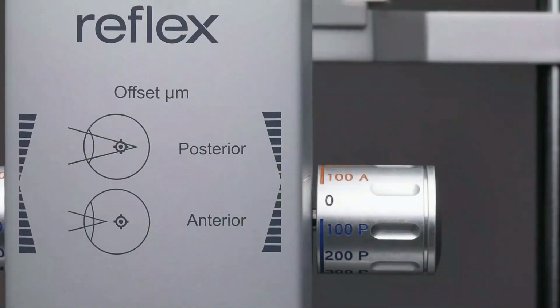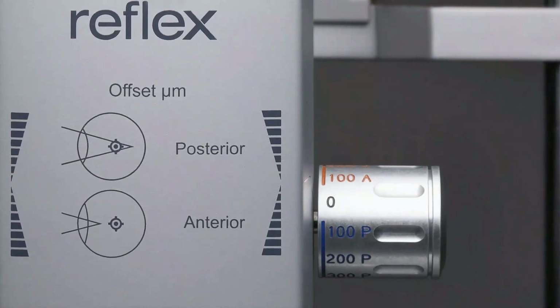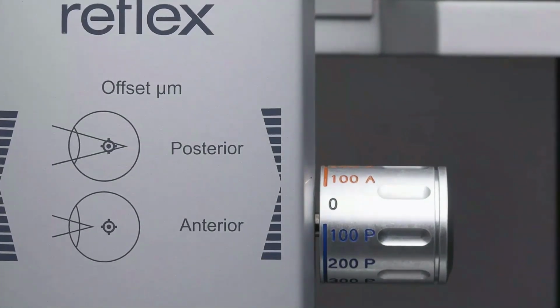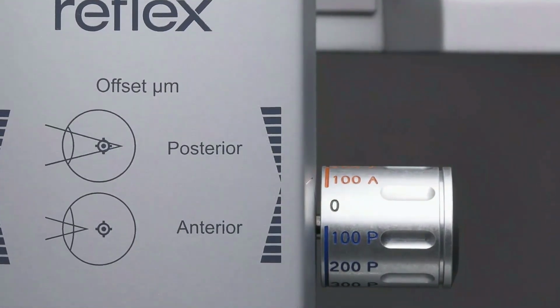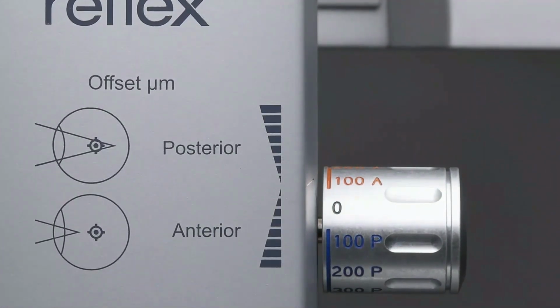Now, with an awareness of the high degree of temperature anticipated at the laser focus, it would make sense to maintain a sufficiently safe distance between the IOL and the plasma formation. Many lasers include a manually controlled offset, allowing you to move the treatment beam posteriorly towards the vitreous by 0.1 to 0.5 millimeters.